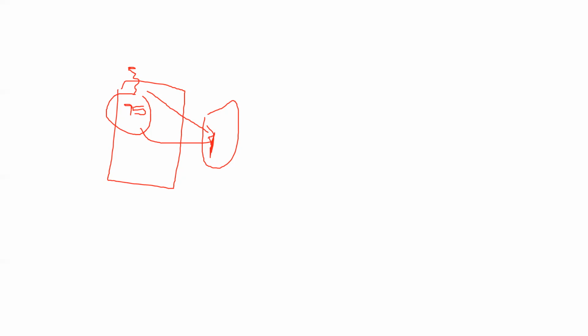All right. We inject 10 mLs. Yeah, and in order to make sure that we did it accurately, we usually do it 3 times and take the average. Okay.